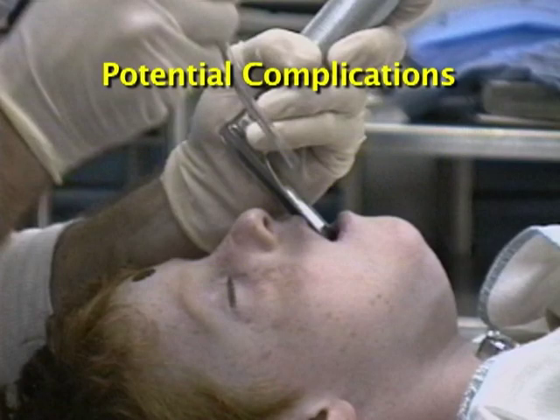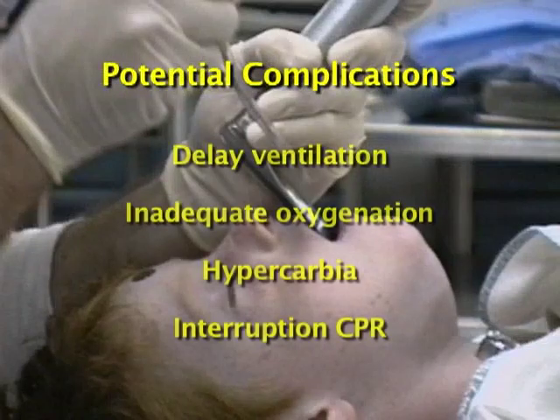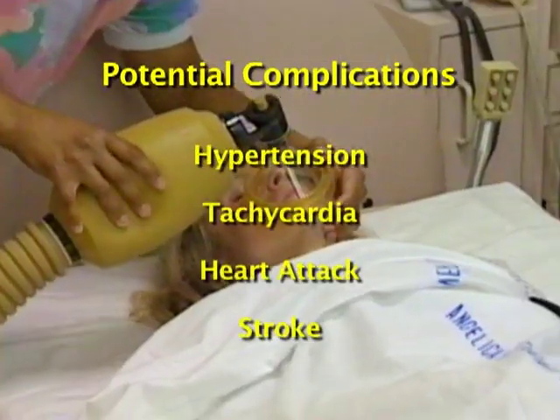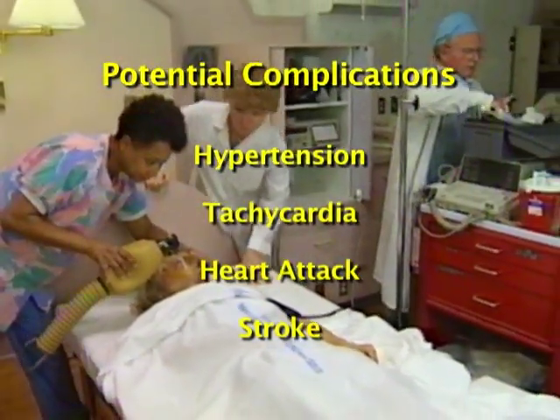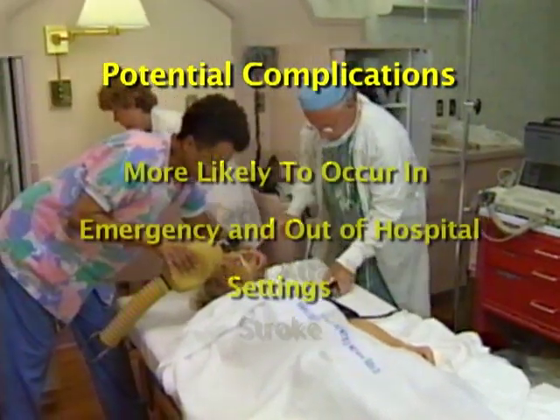Complications can occur during and following intubation. First of all, the process of intubation can delay ventilation and result in inadequate oxygenation, hypercarbia, or interruption of CPR for greater than 15 seconds. In addition, the stress of the intubation can cause physiologic responses that can put the patient at risk. Hypertension and tachycardia increase the risk of heart attack and stroke.